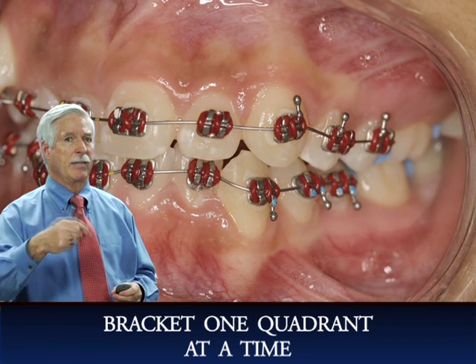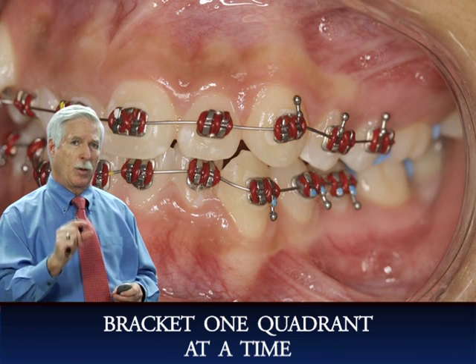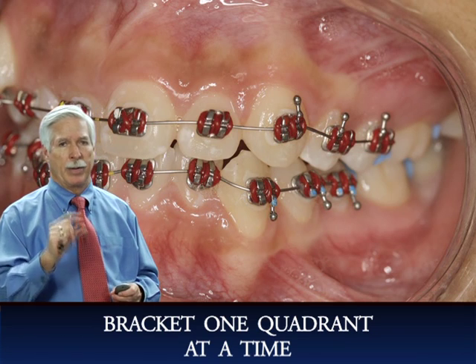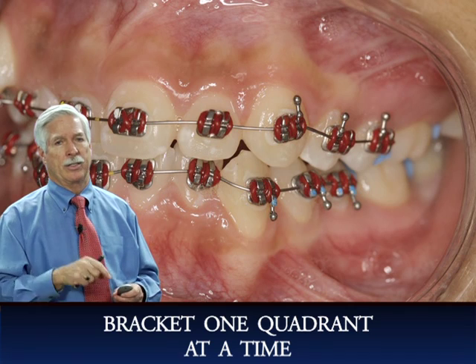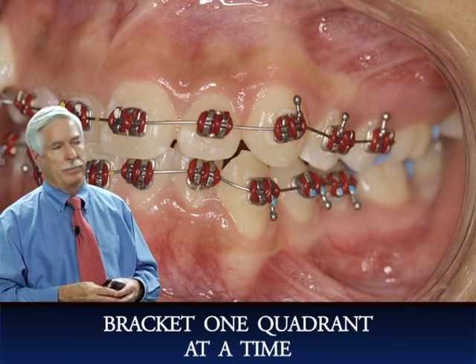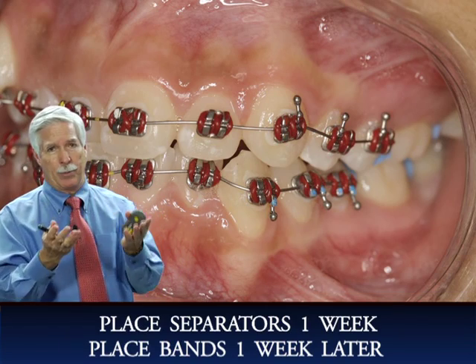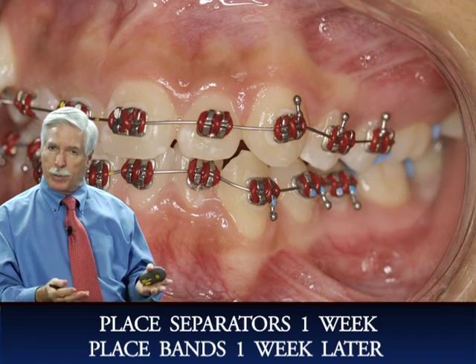Remember, only take your activator out to do 1 quadrant at a time, because the activator can only be exposed to air for 10 minutes. After that, it loses its effectiveness. So it's a very pleasant appointment. Put the separators in, mesial and distal to the molars in the upper and lower, and bring the patient back in a week and put the molar bands on.